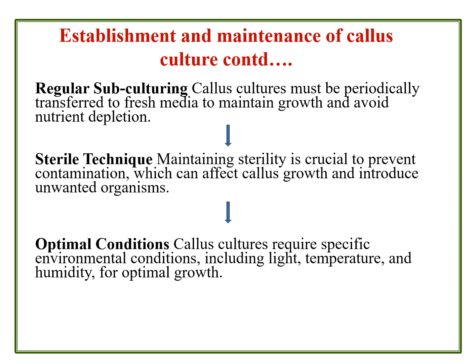And then sterile technique. Maintaining sterility is a very crucial point to prevent contamination, which can affect callus growth and introduce unwanted organisms.